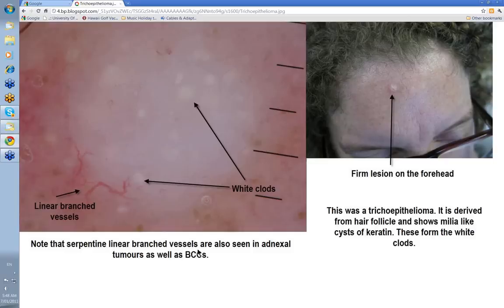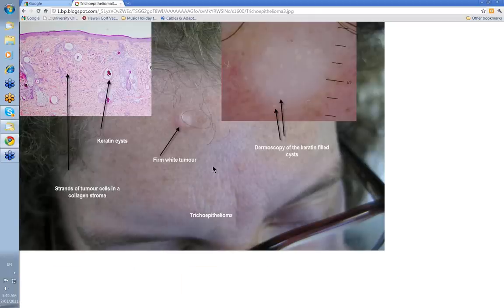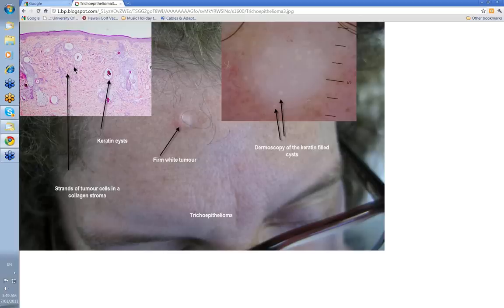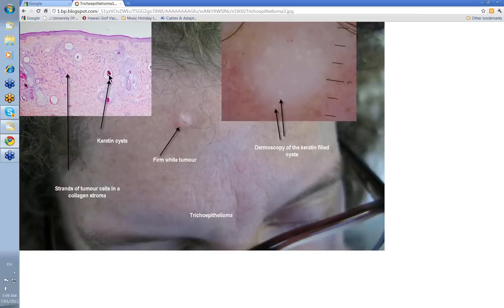You can also get serpentine branched vessels in BCCs. Occasionally you can get some white clods in BCCs too. This is just a close-up of the last patient — the clinical lesion, the dermoscopy, and the histology. The major feature you're going to see are strands of cells surrounded by a collagen stroma, and some of the keratin cysts. These are much more dermal rather than epidermal. They vary in size — the more superficial they are, the more they look like milium cysts. But they are quite deep, because they're derived from hair follicles.